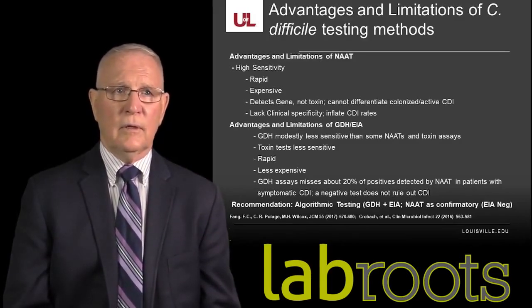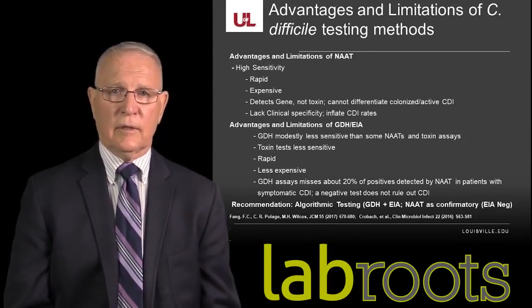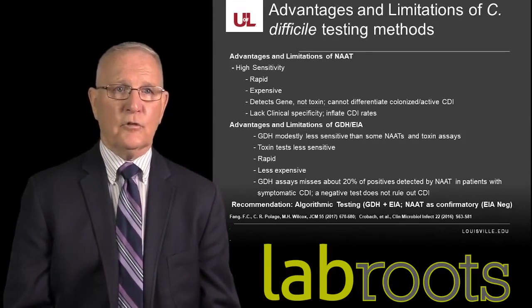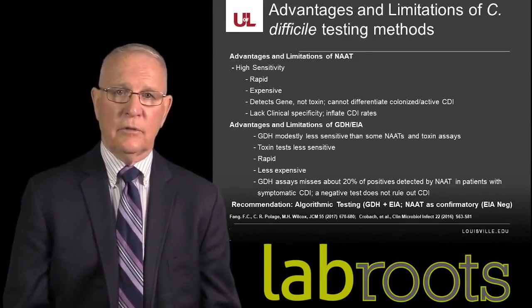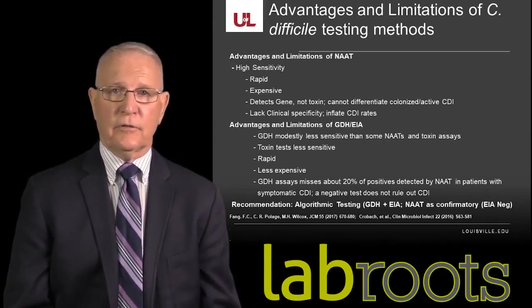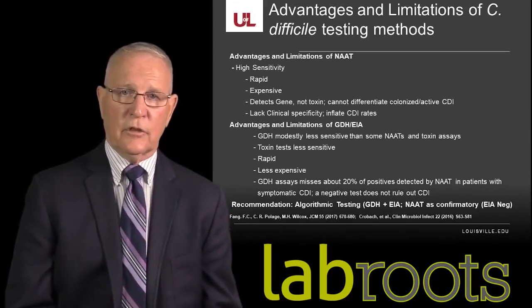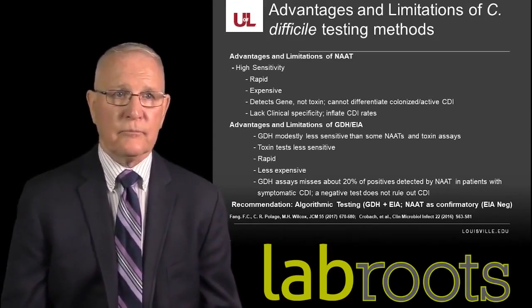Overall, the molecular assays for C. diff, like any molecular assay, lack clinical specificity. And when you have this deficiency in clinical specificity, it inflates your CDI rates and the consequences that I just mentioned with regards to reimbursement and excessive cost to the institution.